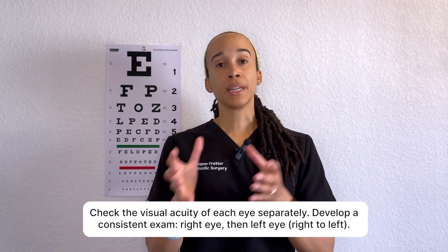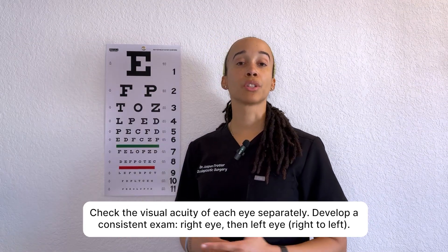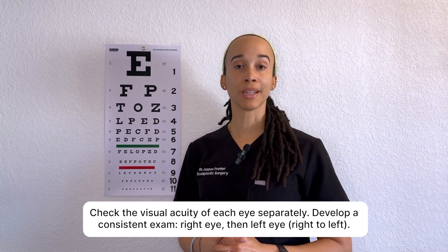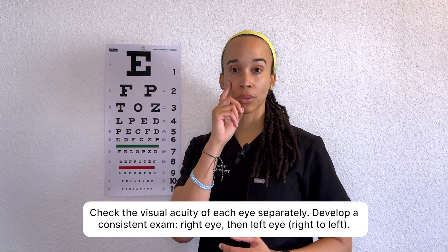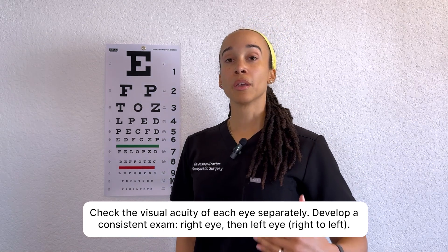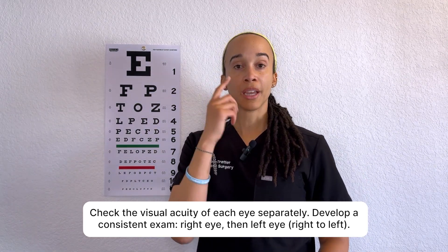Although we have two eyes, treat each eye separately — check one eye at a time. If you check both eyes together, the patient may appear 20/20, but you could be missing that one eye has a problem. For example, the right eye could be 20/20 while the left eye is 20/150, but because the right eye is so strong the patient relies on it, giving a false representation of what's really going on. So you want to temporarily occlude the eye you're not testing.